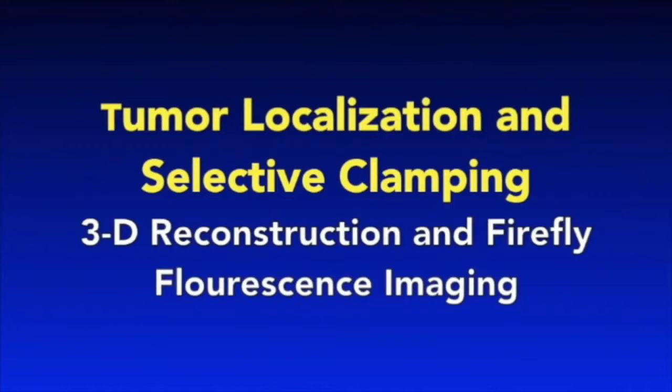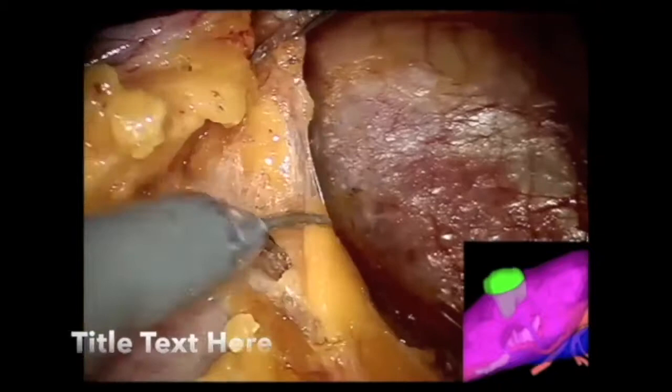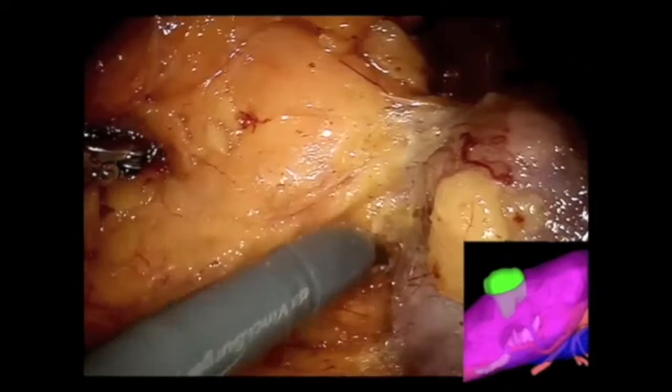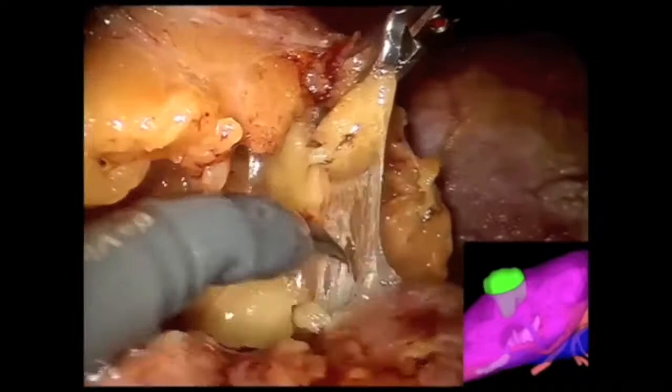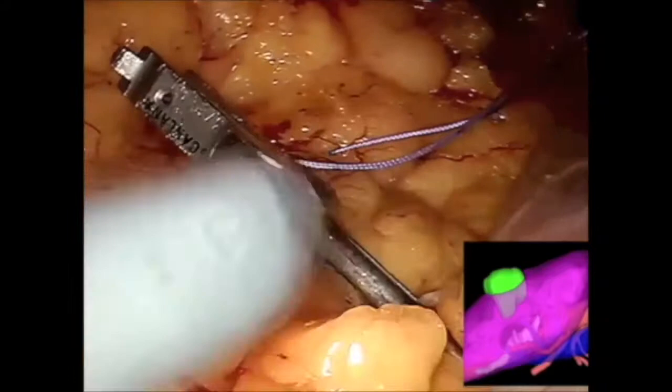Using the 3D model to predict tumor location, a posteriorly based mass is isolated from surrounding perinephric fat. The model also predicts the location of the posterior branch of the renal artery, and this is clamped in preparation for selective arterial clamping.